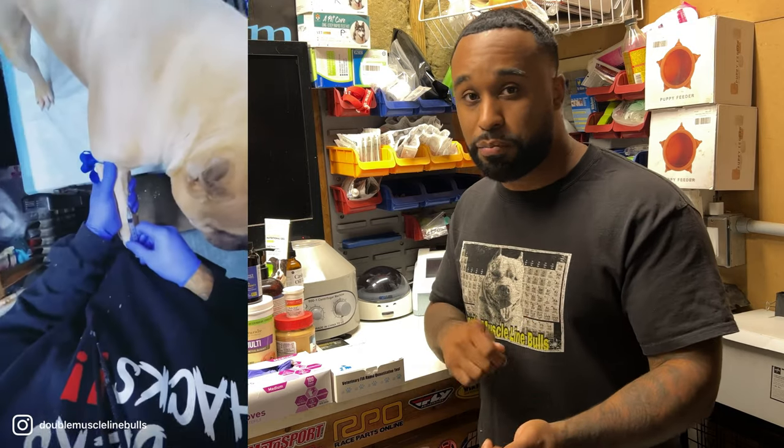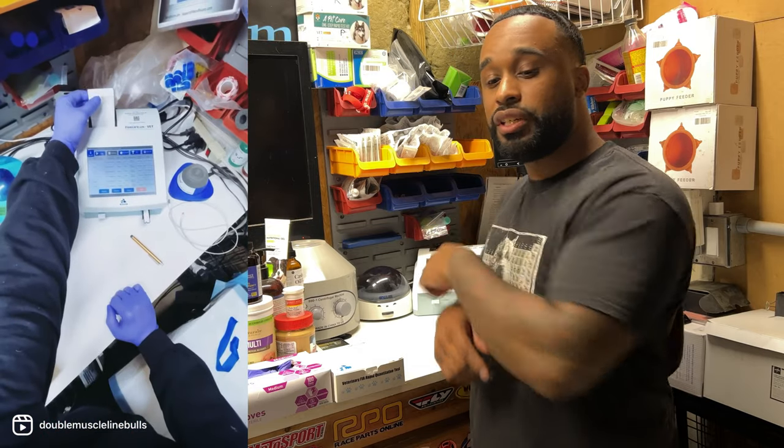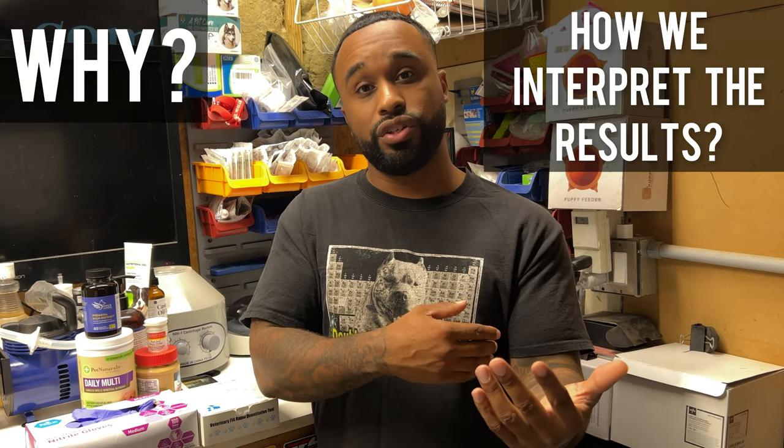Regular progesterone test — the same exact way you would get a progesterone test done, where you're drawing the blood, spinning it down, putting the serum on the cassette strip, putting that inside the progesterone machine, giving you a number. It's the same exact way. So the only difference is really why we're doing them and how we interpret the results.